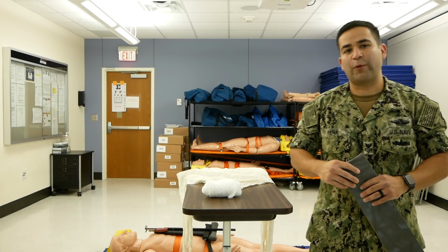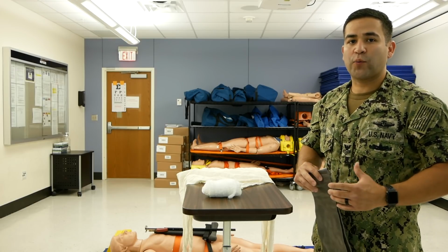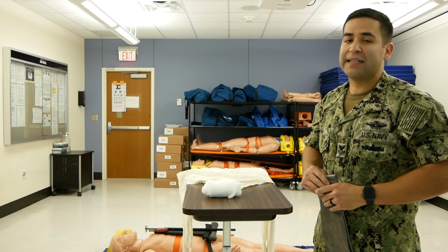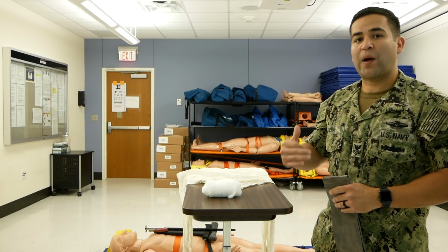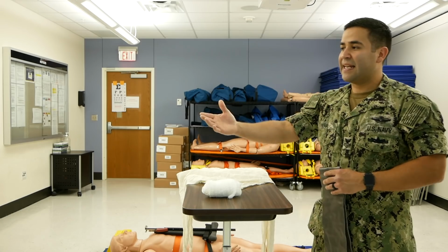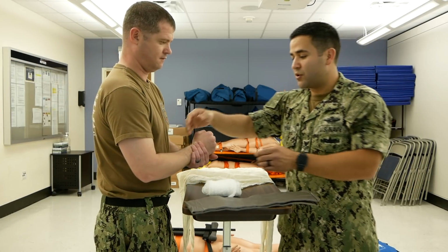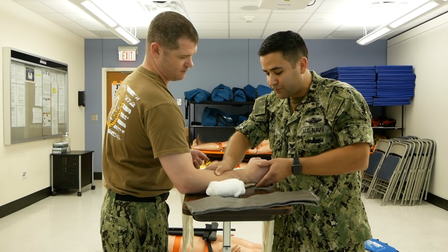The second portion of Performance Test 20 will be the SAM splint and sling and swath. For this one, we're going to demonstrate splinting a wrist fracture. The patient's right wrist will be the affected wrist. So when the patient comes in, I see that it is a right wrist fracture. You want to go ahead and immobilize that arm.